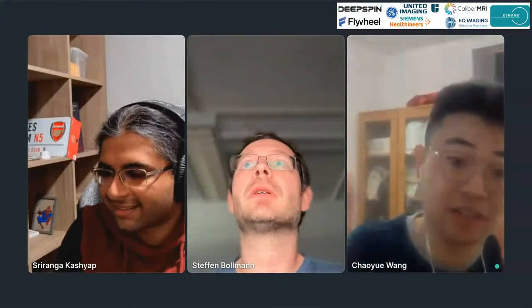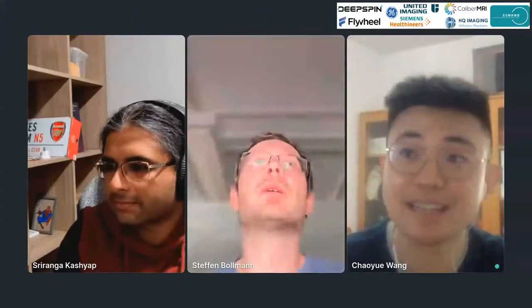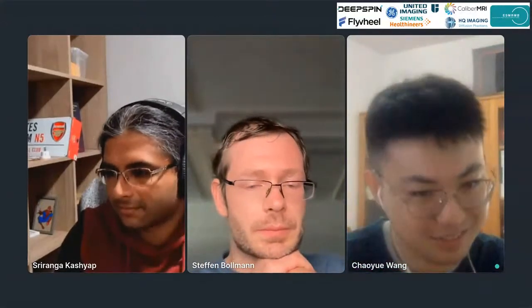Yeah, that's a great question. So I had a slide that showed different combinations of the algorithms, the effect of that on the final QSM maps, averaged over 1,000 subjects, for instance, and we can see that there are dramatic differences with the same set of subjects, but just processed using different combinations of algorithms. The averaged QSM maps look quite different. So that is the problem with QSM in general.